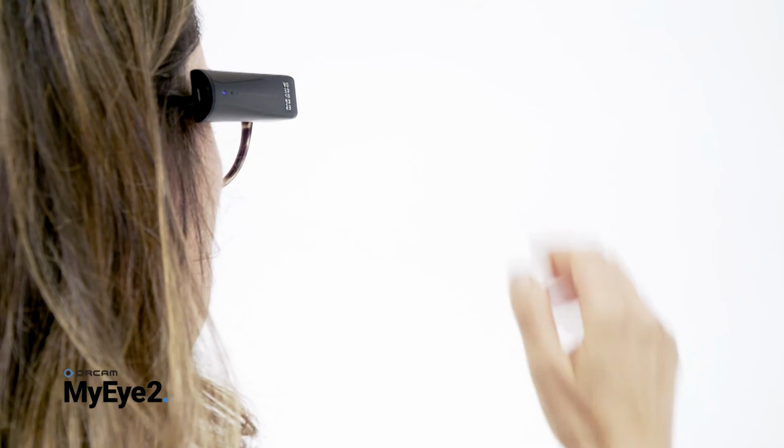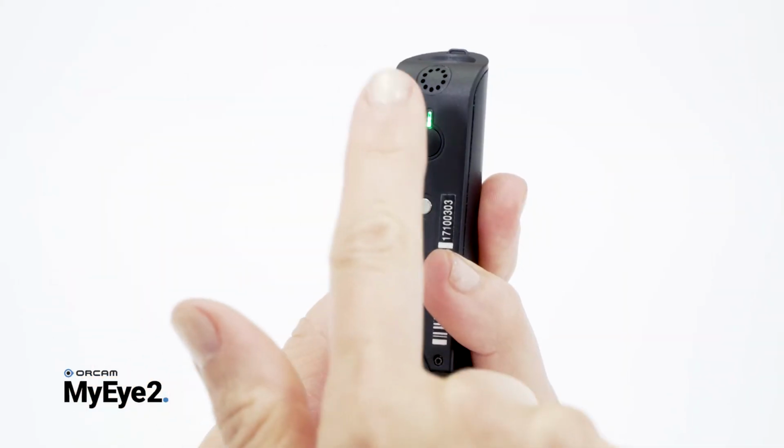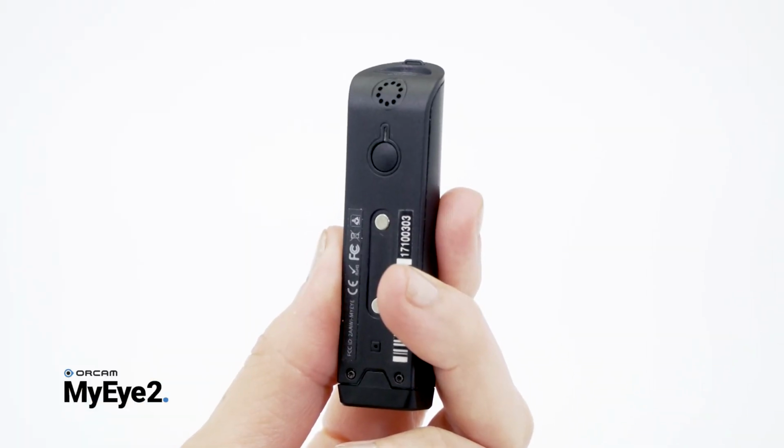To turn off your OrCam device, press the power button twice, once to suspend, "Suspending," and again to shut down. "Press again to shut down. Shutting down. Please wait. Power off. Bye-bye."